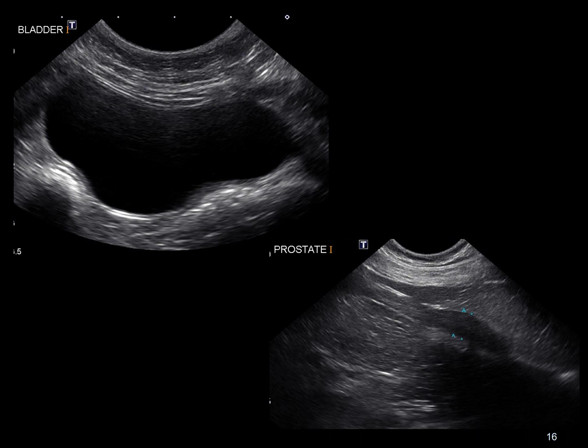Bladder should be nice and anechoic. At least the urine should be anechoic. The wall you should identify as the echogenic, fairly thin structure. And then a prostate, you can kind of follow the urethra as being a hypoechoic band. The prostate in a neutered dog is going to just be a small swelling around that urethra. If it's an intact dog, it'll be bigger than that.